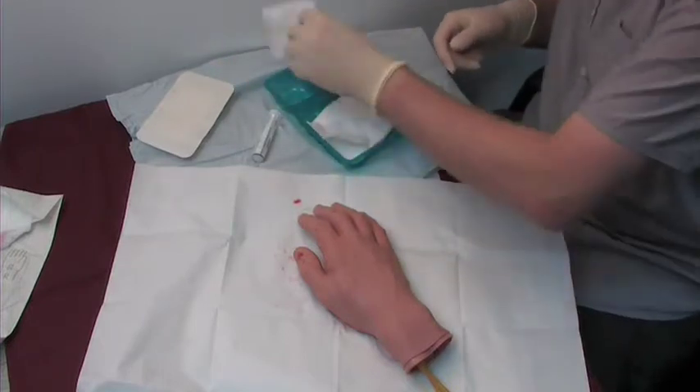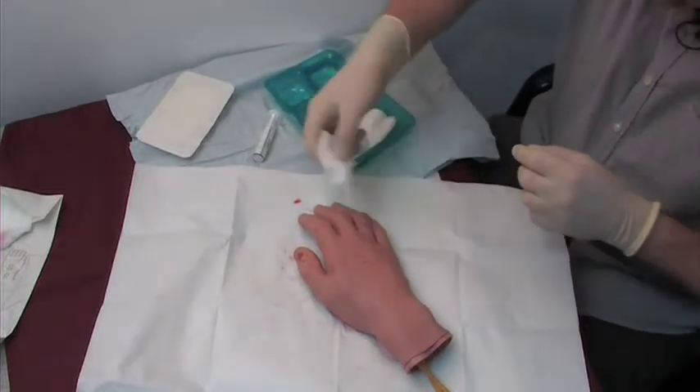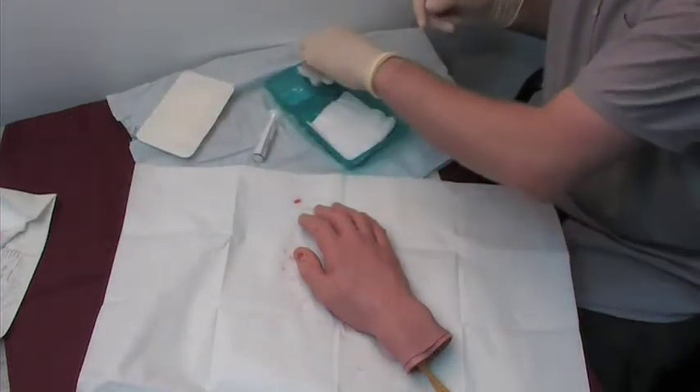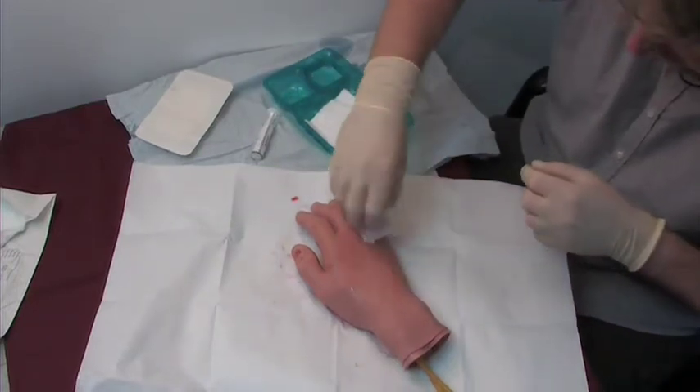So the wound — picking up with my left and using my right just to give it a wipe over. Picking up with the left, using the right just to get the surrounding tissues nice and clean.